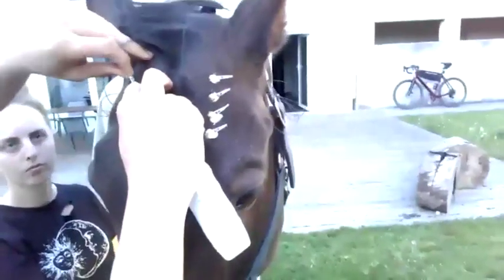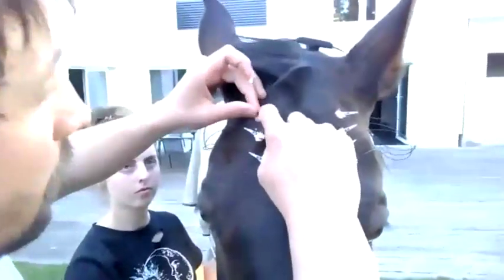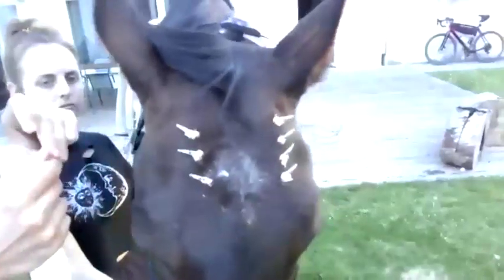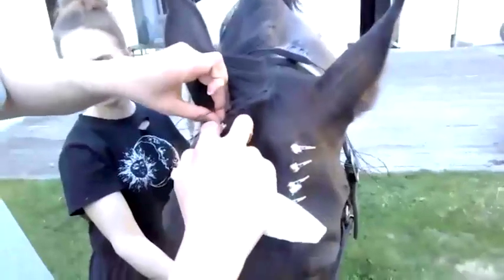Of course, Dreamy doesn't have too much hair, so it's quite easy. With dogs, sometimes you really need to lift up the hair. We have number 7. I try to put the hair back a bit, just so it attaches a bit better and we also have less movement of the last electrode before we come to the ground. Dreamy agrees on the measurement.